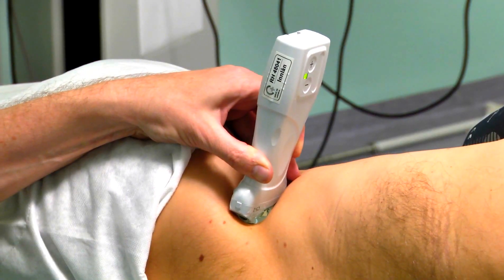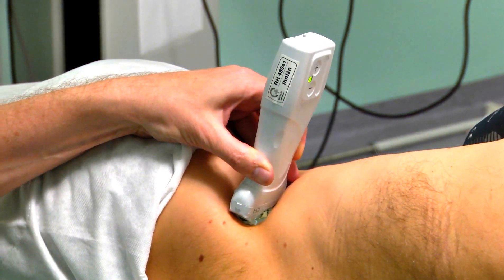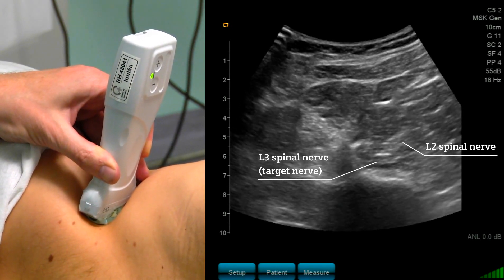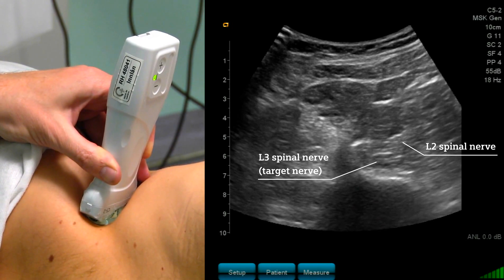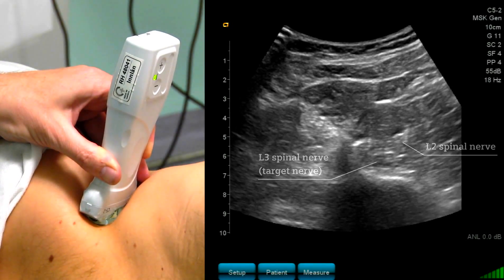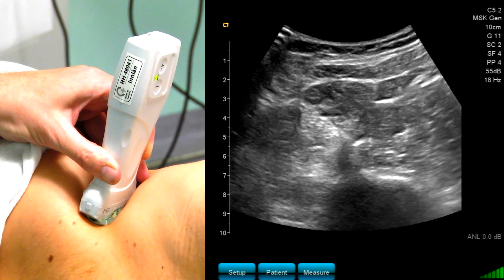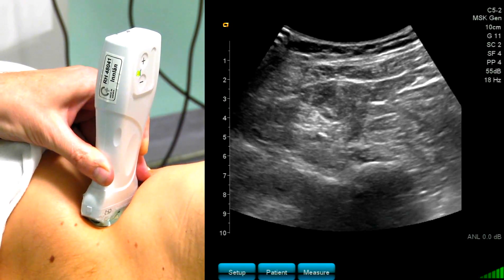When I play a little bit with my probe, we can actually see two nerves and we can also clearly see the L3 spinal nerve. When I move my probe slightly cranially, the L3 spinal nerve will disappear within the spinal channel. This happens here.